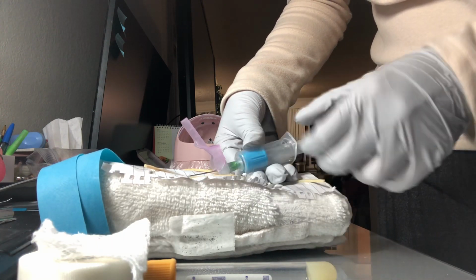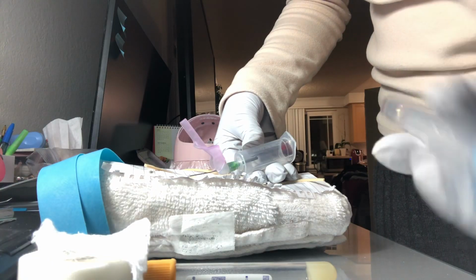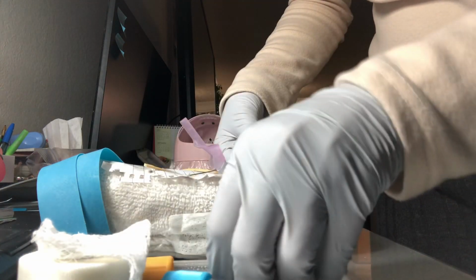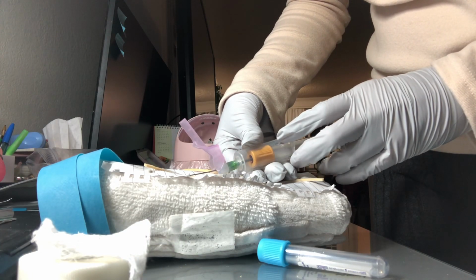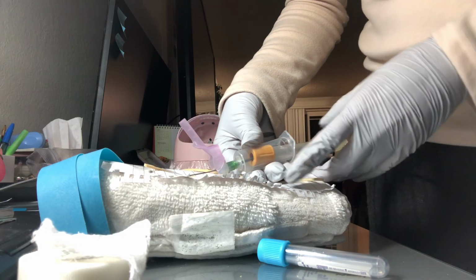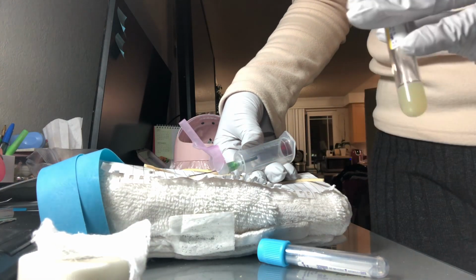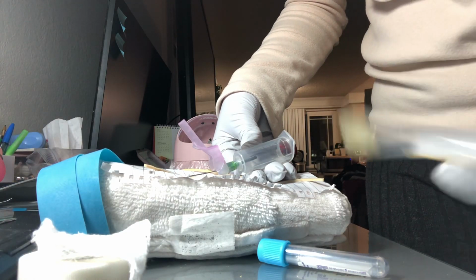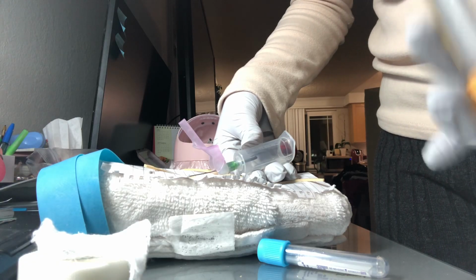Sorry, my arm got moved. And invert it four times. I'm going to change another tube using counter pressure to stabilize the needle. Remove it also with counter pressure to stabilize the needle, and invert this orange tube about six times.